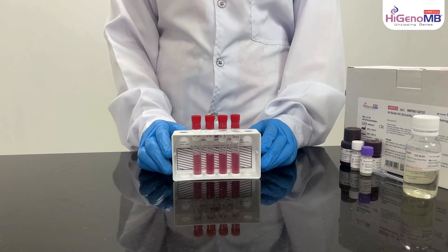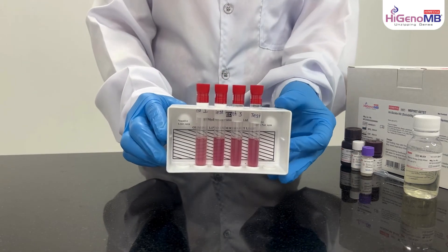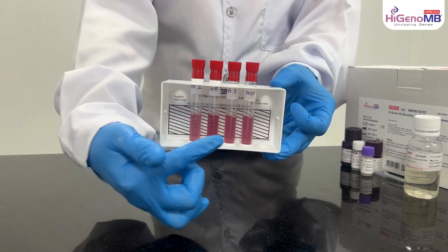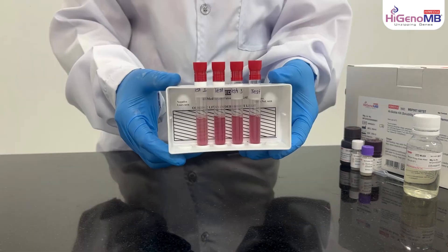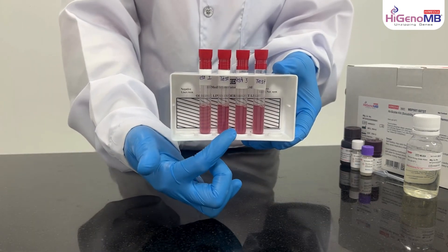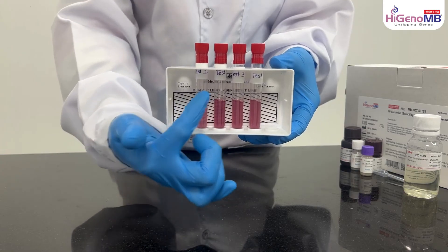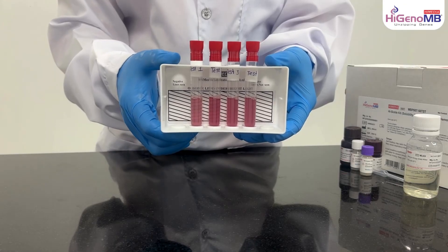After that, read the result. For interpretation of result, we have to see whether we can observe the black lines or not. In the first two tubes, you can see the solutions are not turbid and we can see the black lines which are behind the tube.